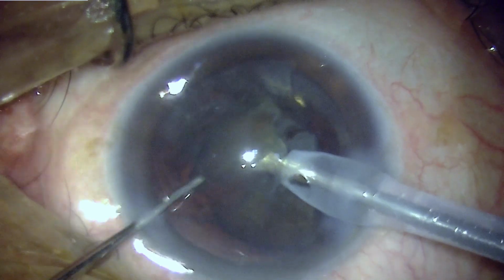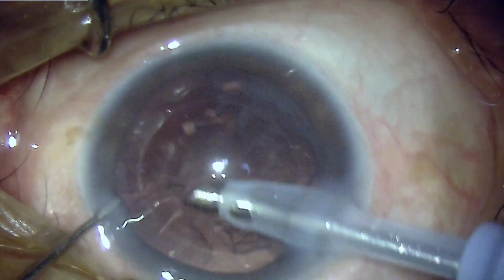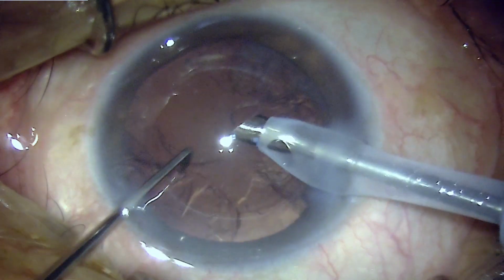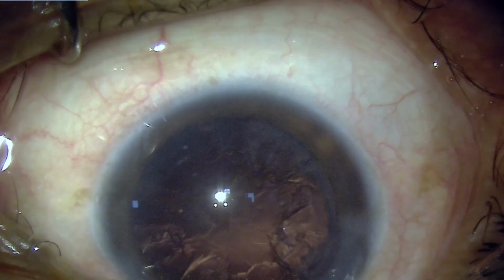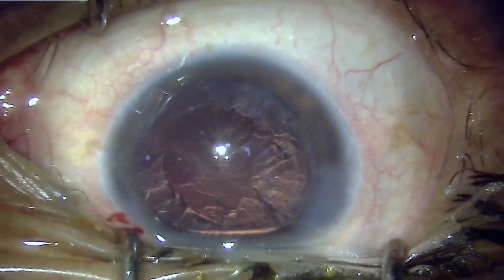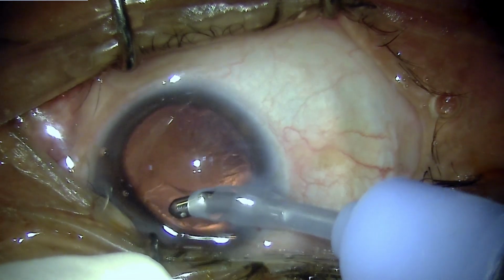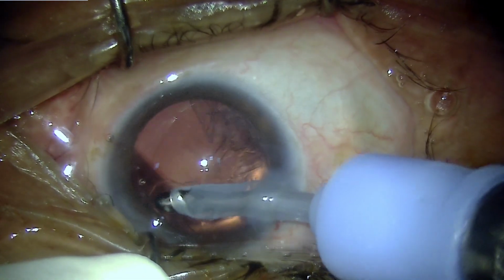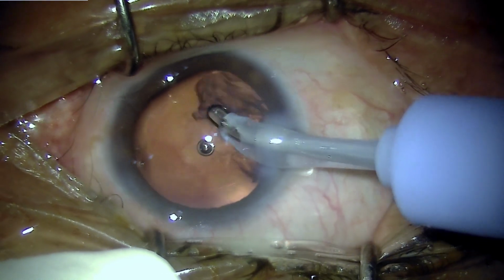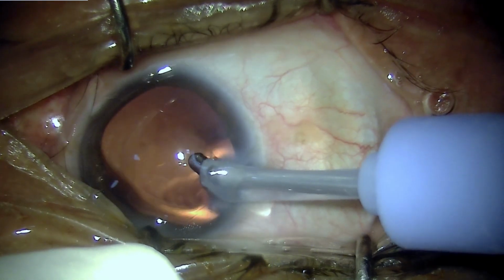And this portion is being run at 1.5 times the normal speed, just so that we can reach the point of interest as soon as possible. This surgery is being done under topical anesthesia, and we'll see what happens next. So this is some amount of cortical matter which is remaining, and we usually remove this using an irrigation aspiration cannula, and that is being done here. So the subincisional area is typically vulnerable for problems, and we'll see what happens.